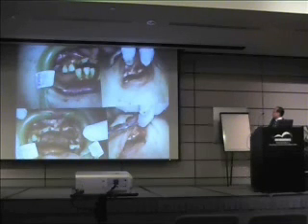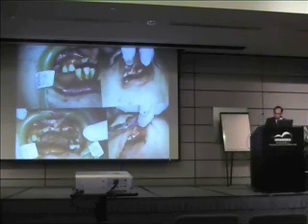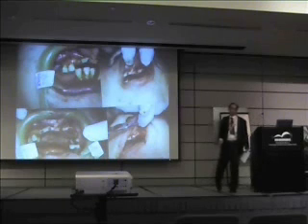We have to take out that tooth. We put two implants for her there, and two implants for her there, at that side. Okay? And this was done 2 years ago. In the area where we have taken out the tooth, we placed in Bioglass and stitched it up. Remember, her bone is very thin. When the bone is very thin, you can't talk about conventional implants.